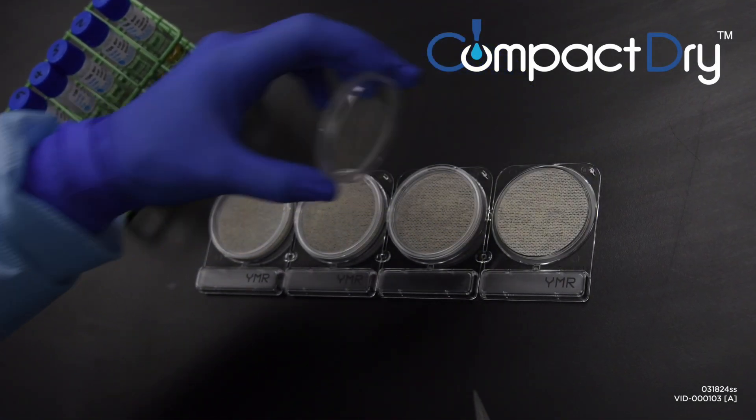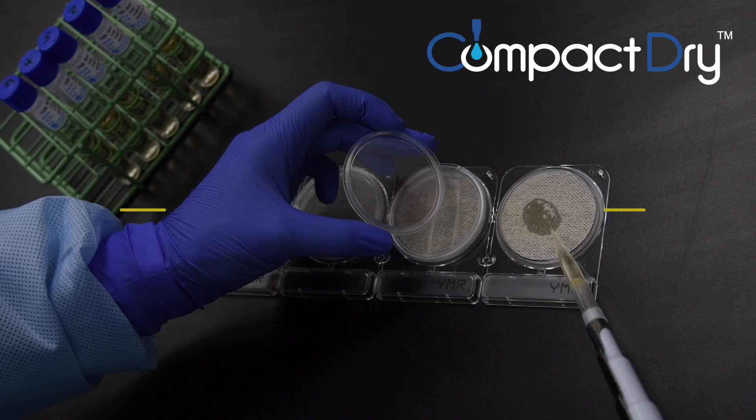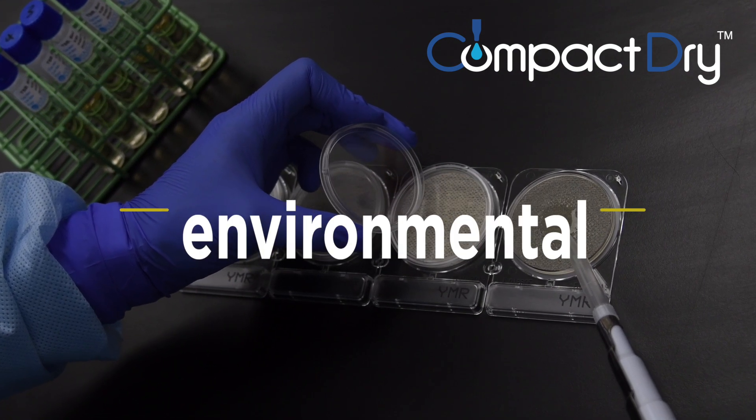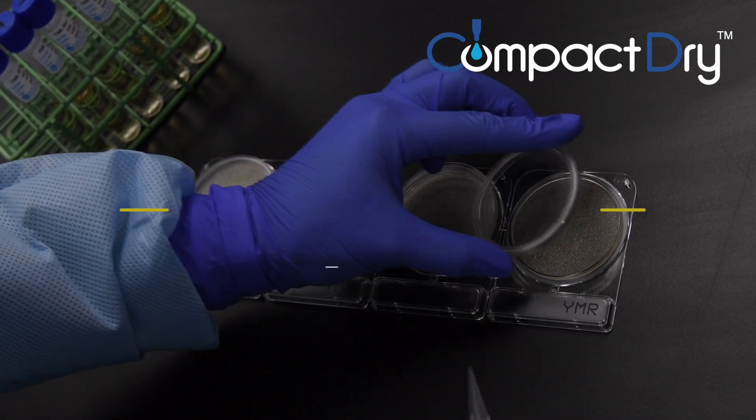The CompactDry plate line is perfect for labs performing serial dilutions and testing food, beverage, cosmetics, environmental samples, raw material samples, and more.